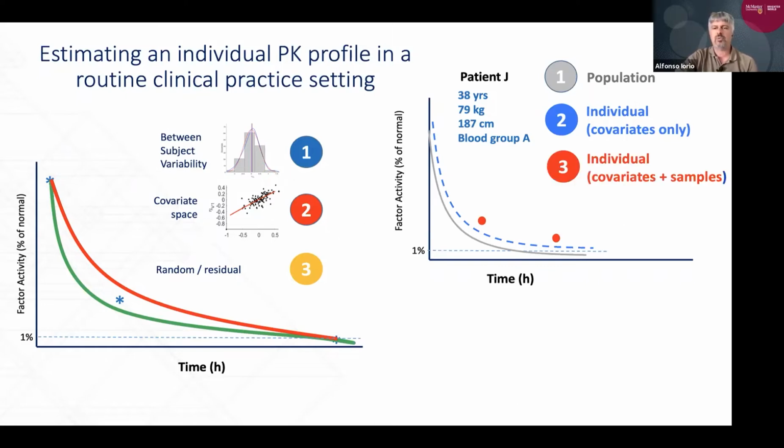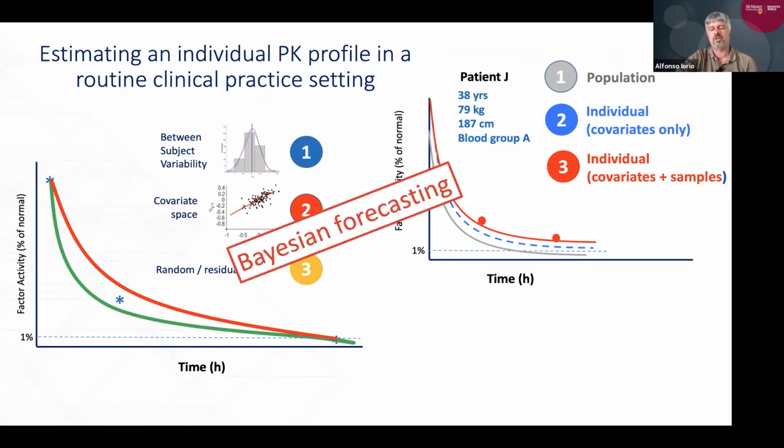Now, if I take two samples and I know the shape and the approximate place of the curve, I can move that curve to go through those two samples. This is why WAPPS can do a very good approximation of the perfect line for that individual patient with only 2-3 samples, because it builds on the information of the tens of thousands of PKs we have done to guess what the shape is and where the approximate place is for that patient, and then 1 or 2 samples are enough to confirm that's the PK for that patient.